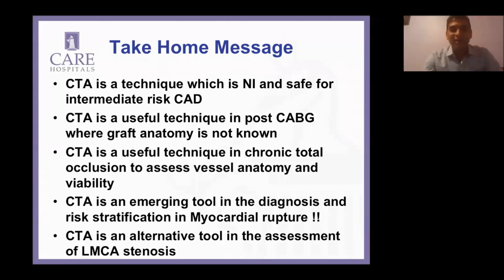Most of all, the usage of CT during interventions. But I have a basic question on the diagnosis of coronary artery disease. So now we have an increasing surge of CAD in young patients. Many of our relatives come up for screening for CAD. Most of the time we do ECG, TMTs, and we say there is no problem, but they keep on pestering us. Is there any other investigation to rule out CAD? Ultimately, we end up sending the patient for a CT angiogram.